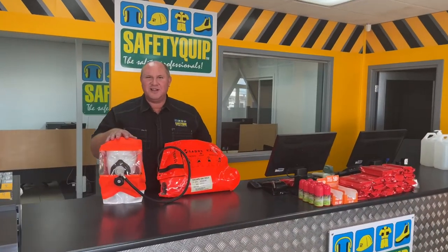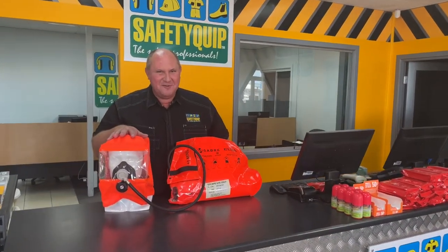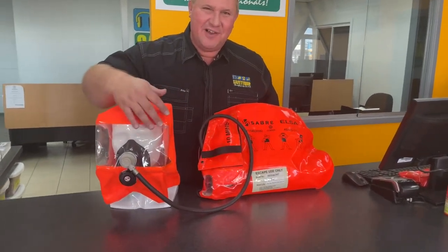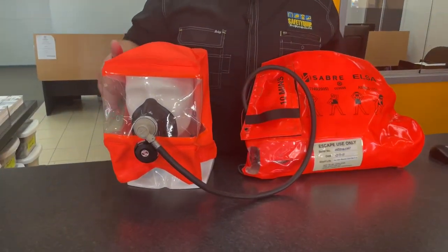This is how the hood looks on a head — I've put it on my colleague here rather than myself so that I can keep talking. You'll see that there's a clear visor that allows excellent visibility; it's 180 degrees.